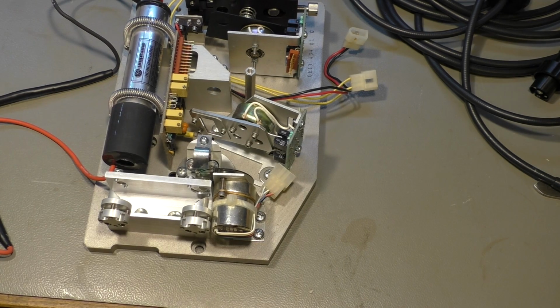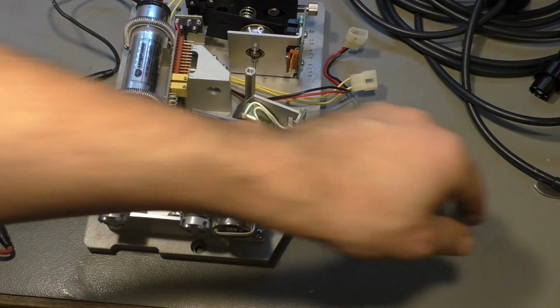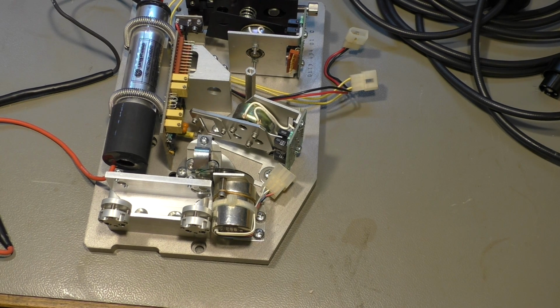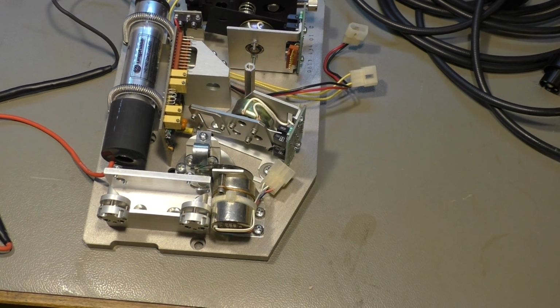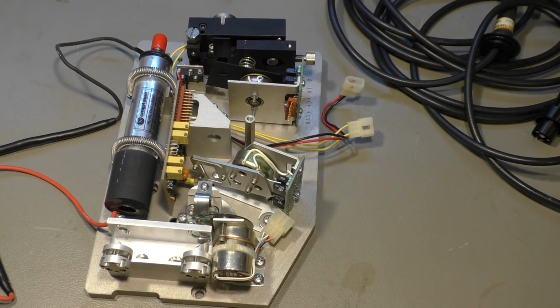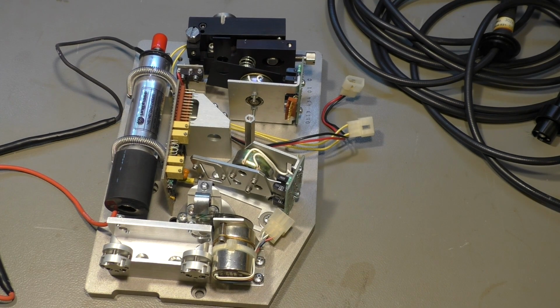Now green is desired for all kind of surgery that has to do with blood, because blood is red and absorbs the green light very well, so it heats up and you can, for example, stop bleeding with green light. Well, I think that's about this unit. There's not much more than this.